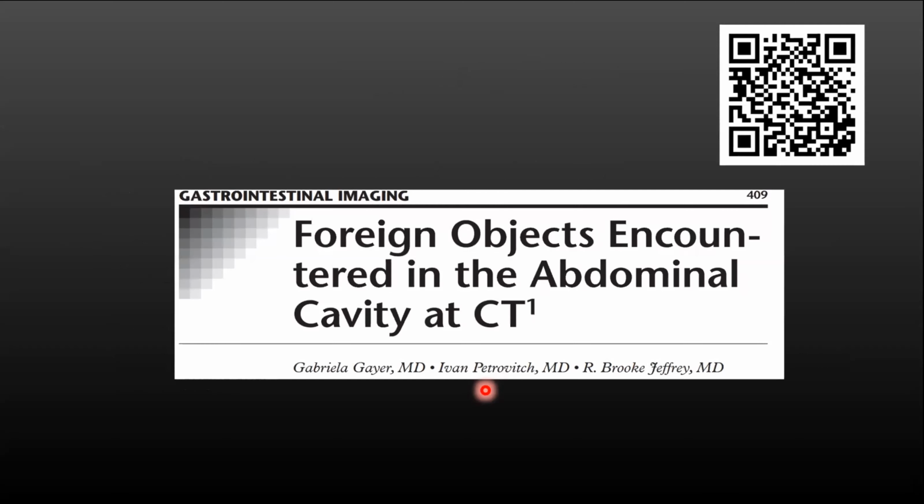I would like you to refer to this article. You can scan this code by your mobile. It will get you to this article about foreign objects encountered in the abdominal cavity on CT scan.